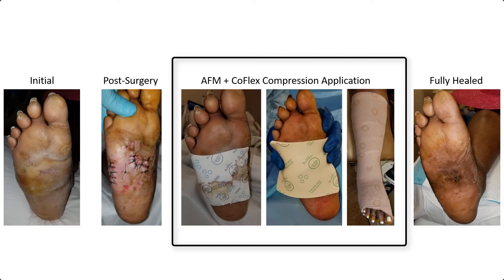With the way the wound is now, the goal is to cover it back up with another layer of Tritec Silver dressing and a compression wrap with the two-layer CoFlex. At this point, we were able to get better control of her leg swelling.